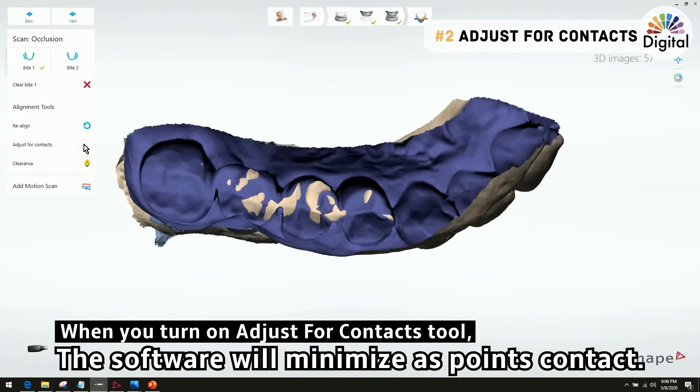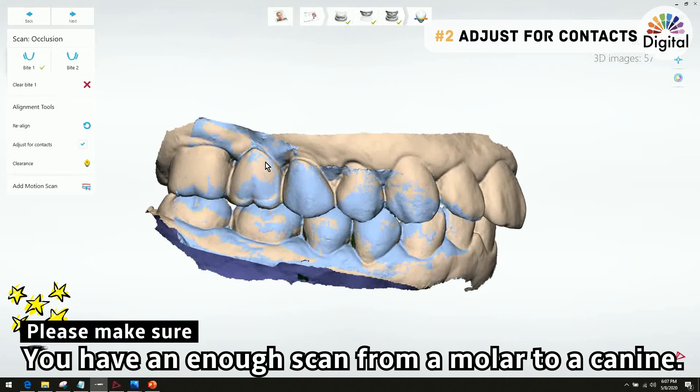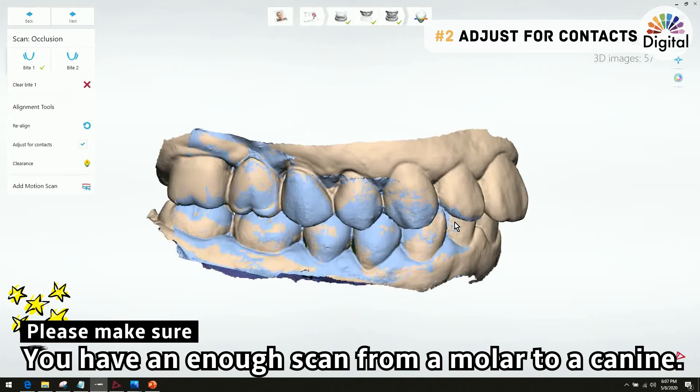Whenever I turn on this tool, the system adjusts to minimize the contact point. What this means is it finds the first touching spot — the first touching point — leaves it there, and adjusts around it. This adjustment works from the bite data, so if you have a short or not enough bite scan data, this adjusting work will not work well.